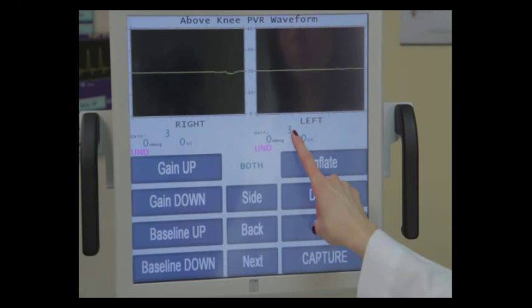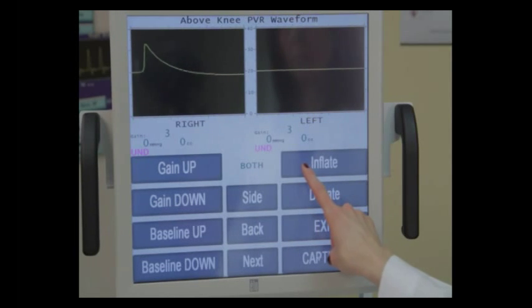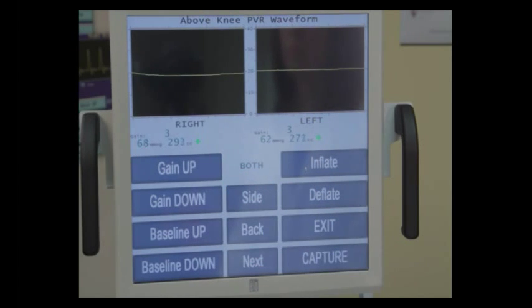Once you set the gain the first time, it will stay at that gain setting for the duration of the exam. So we're going to press the inflate button again. Look for the green diamonds, making sure our cuff inflation pressure is between 62 and 68.